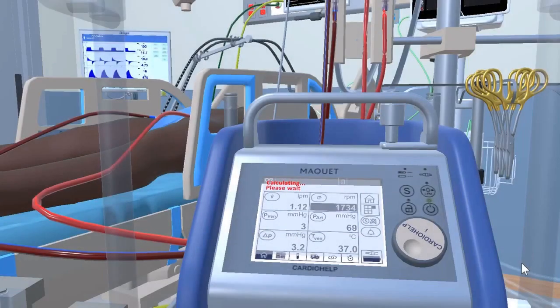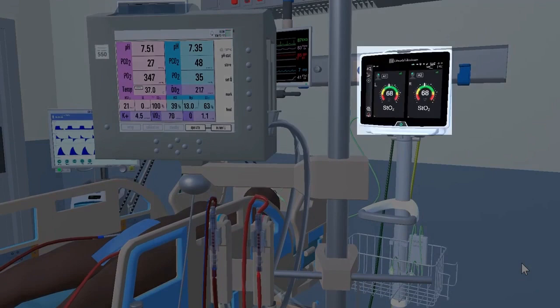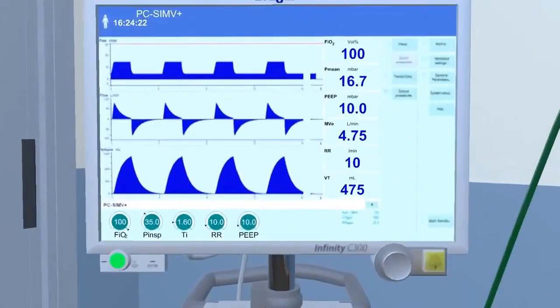Let's take a look at the cerebral oximetry sensor readings. Notice O2 sats have increased considerably. The Terumo CDI 550 inline blood gas analyzer is being used to monitor pre- and post-oxygenator blood gases. Currently this patient is partially on VA ECMO, so let's approach the ventilator and lower the peak inspiratory pressure.